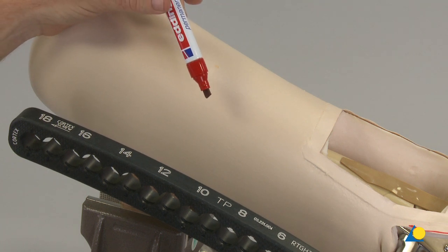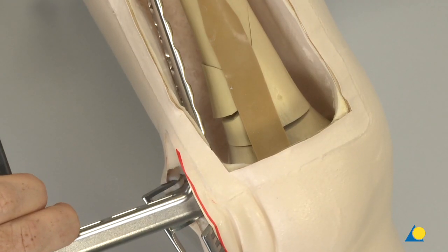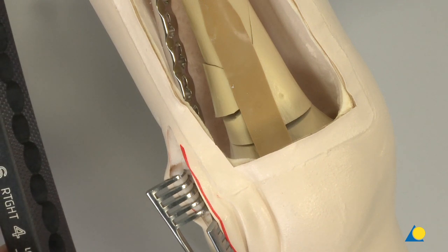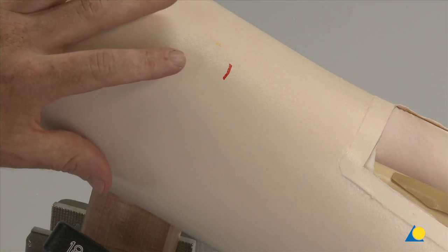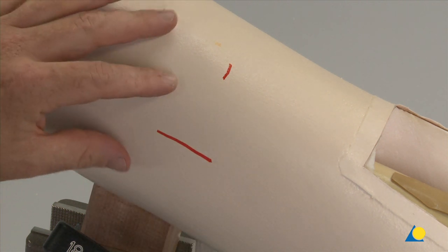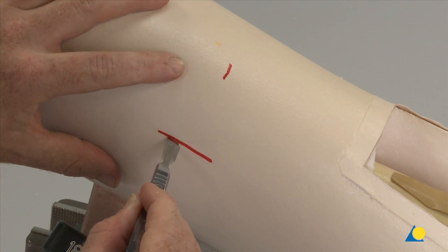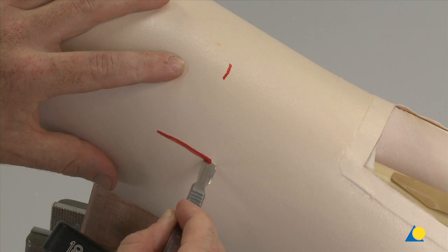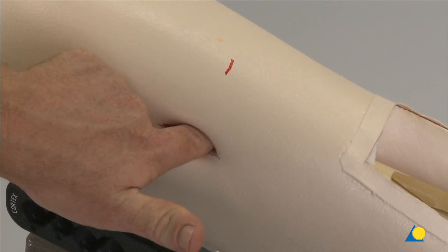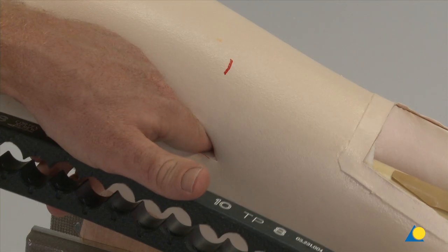Mark the position of the most proximal plate hole on the model. Pull back the plate. Make an incision over the planned proximal plate hole. Insert a finger into the incision and palpate down to the bone. Slide the plate proximally. Use the finger to guide the plate to the correct position on the bone.